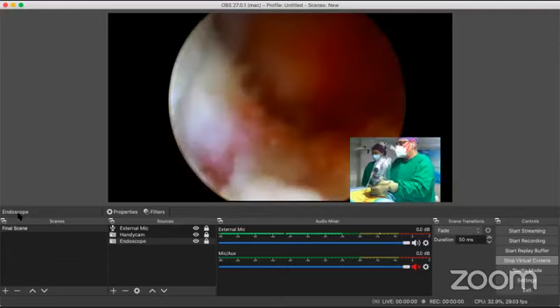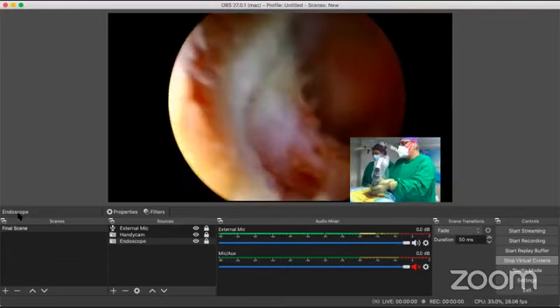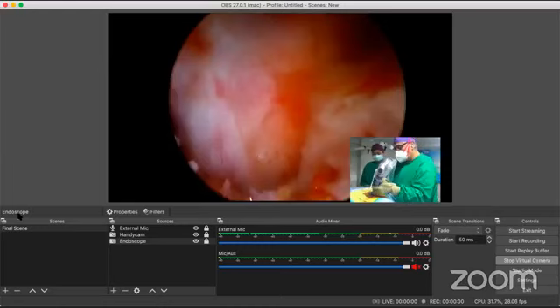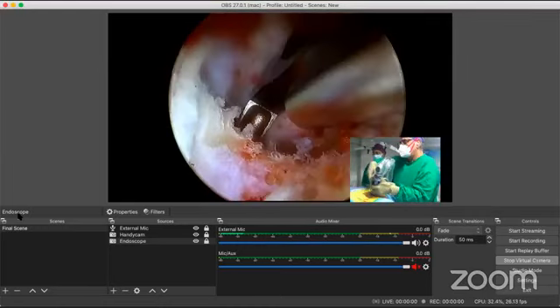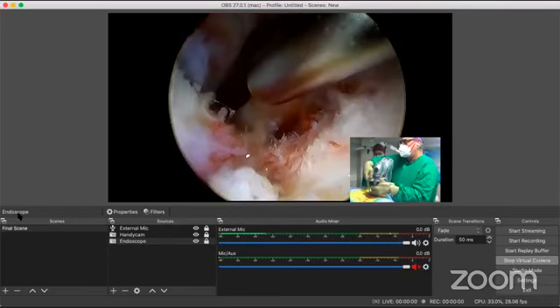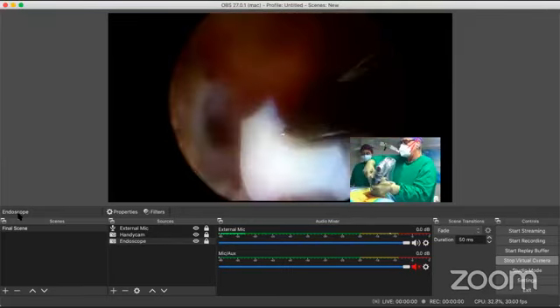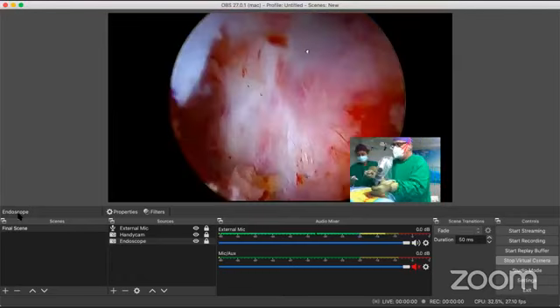And our end point is almost reached what we had initially marked. Can you see this outer part? Yeah, we are almost merging with the end point now, slowly but surely. We are removing enough. And this is the tip of the SAP. Can you see the tip of the SAP which has come out? And now you'll see the full root smoothly.